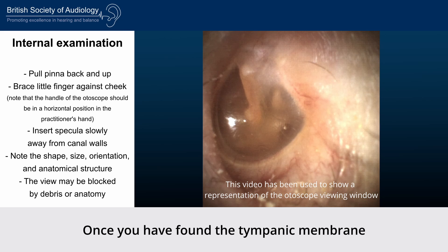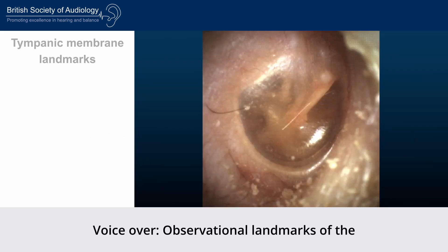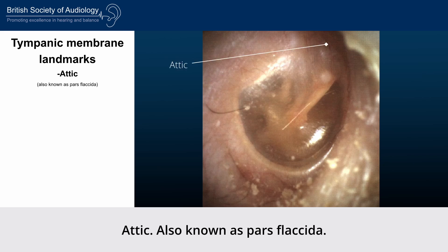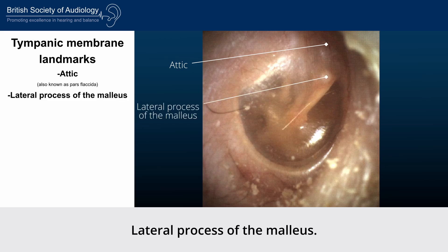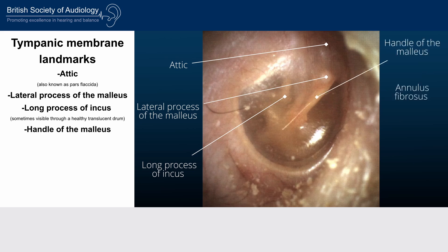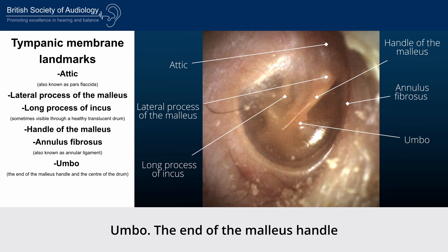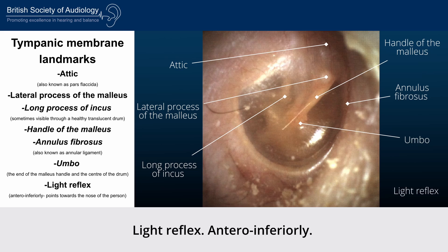Once you have found the tympanic membrane, examine it closely taking a cyclic approach, starting at 12 o'clock and moving clockwise. Observational landmarks of the tympanic membrane include: attic (also known as pars flaccida), lateral process of the malleus, long process of the incus (sometimes visible through a healthy translucent drum), handle of the malleus, annulus fibrosus (also known as annular ligament), umbo (the end of the malleus handle and the centre of the drum), and the light reflex, located antero-inferiorly, pointing towards the nose of the person.